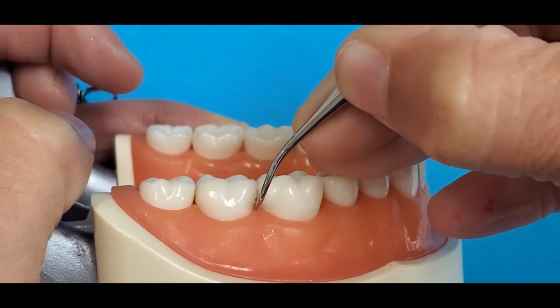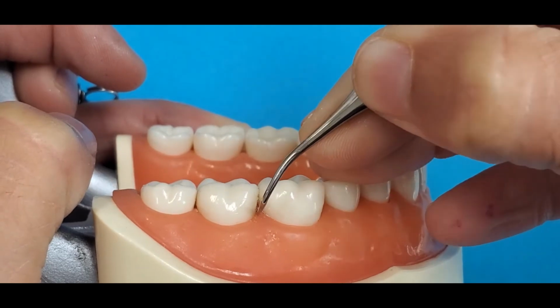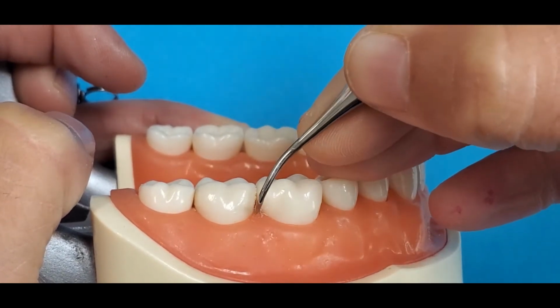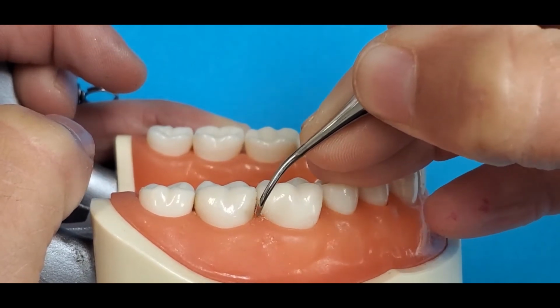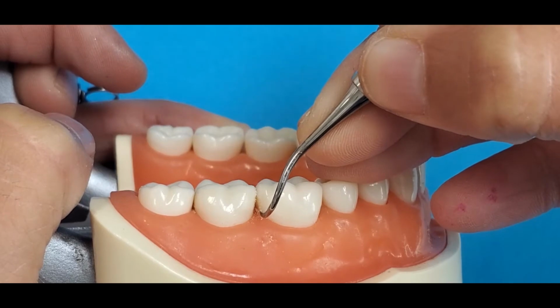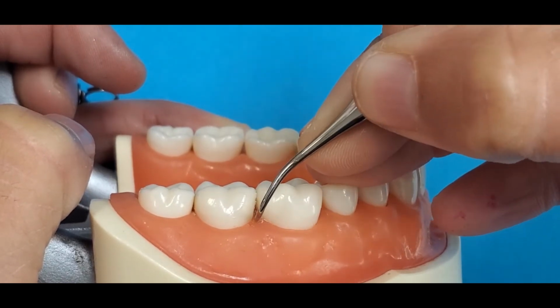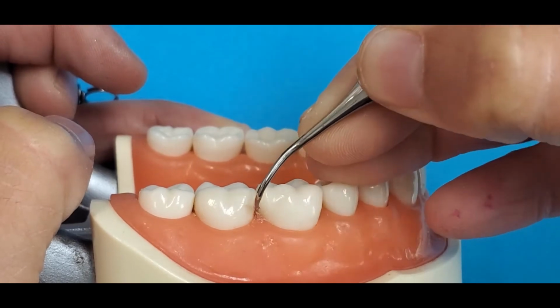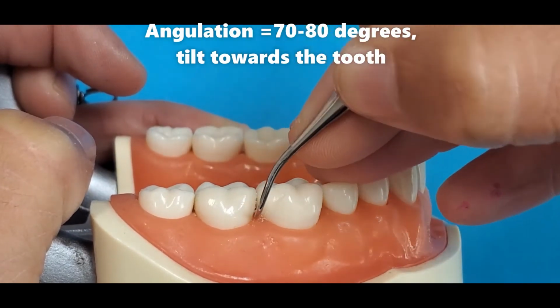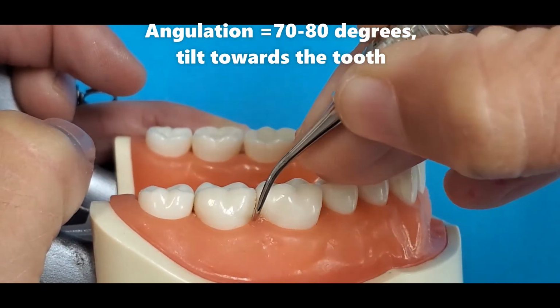When you are adapted and angled correctly, you should see the back of the instrument, not the side, but the back of the instrument. The tip of the instrument should be on the tooth. If the middle or heel is on the tooth, the tip is off. For the tip to be on, it must look like this. 90 degrees would look like this, 70 to 80 tilted towards the tooth slightly.